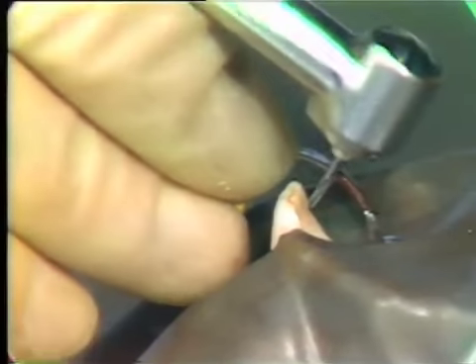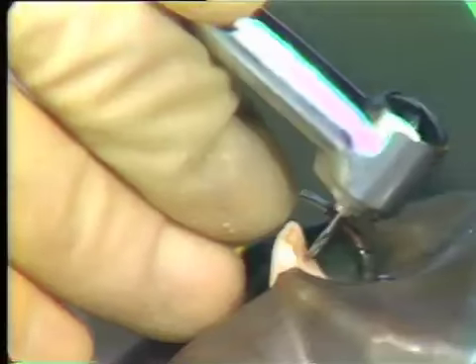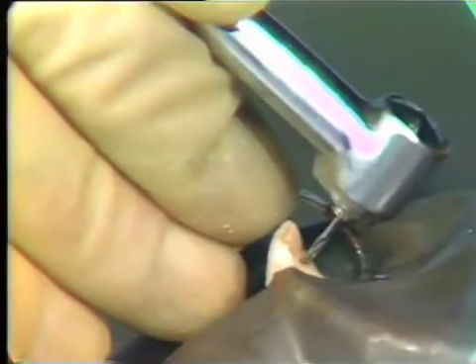Once you have that very definitely in mind, with a high-speed handpiece with a 1057 burr angled at right angles to the surface of the tooth, you establish your tentative outline form and drop down through to the dentin.